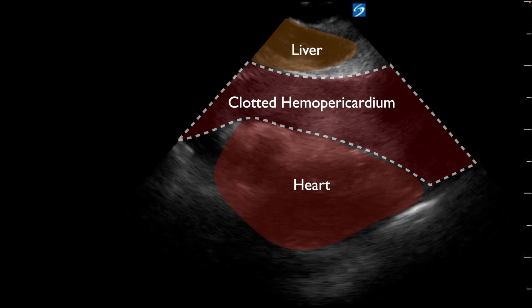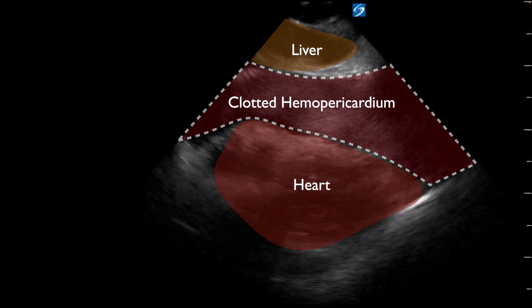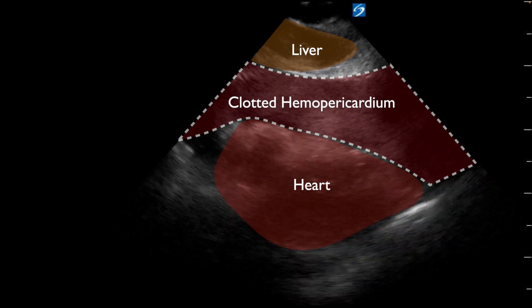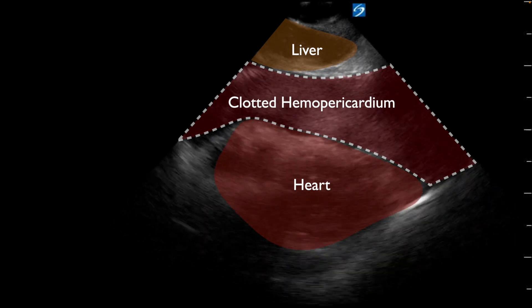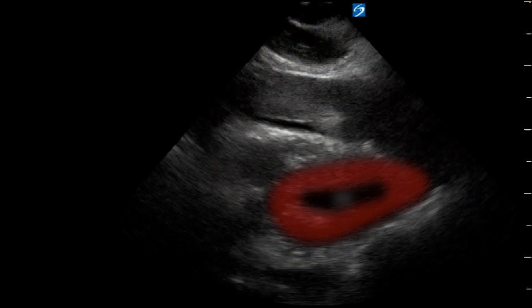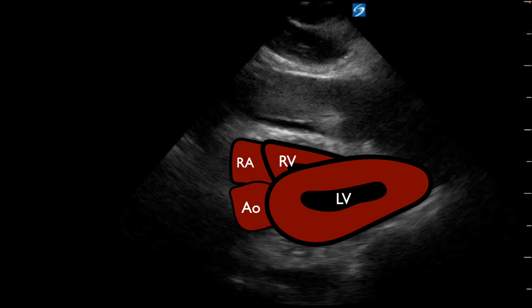Now why can this be confusing? This can be hard in a critical situation to make the right diagnosis. You're often in a very bright room using ultrasound, which can be difficult, with a lot going on around you. Looking at the heart here, we can see the left ventricle occupying this space, the right ventricle occupying this space, the right atria in here, and then the aortic root — so we're a little off-plane, which is okay. This happens in a 10-second pulse check and it can be difficult to ascertain what's going on.